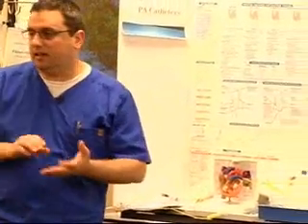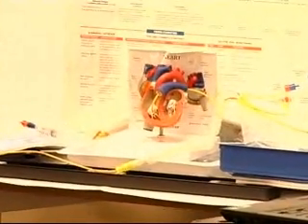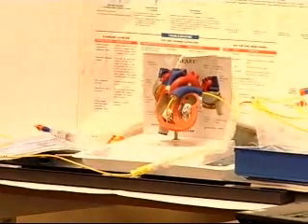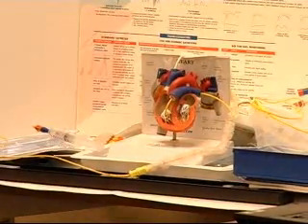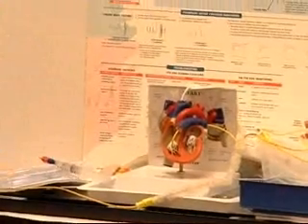Anytime you place a line like that, whether it be any kind of a central line, of course, we always get a post X-ray. That's important too, and I'll show you an example of that a little bit later for placement. Once you've got it in correct placement, oh, actually, it's the next slide, so we'll talk about that.